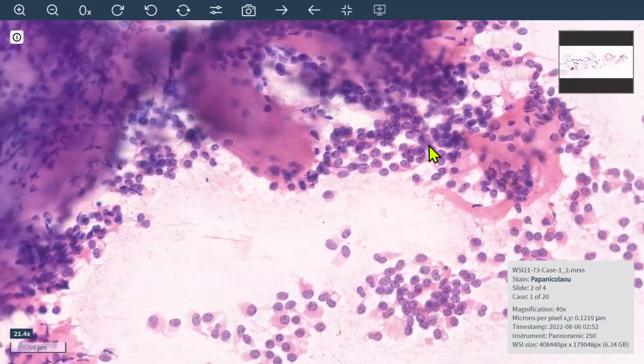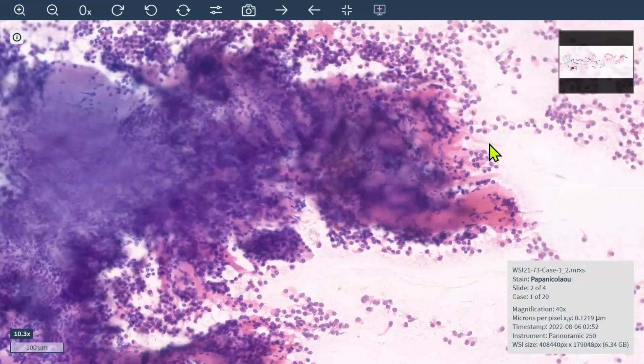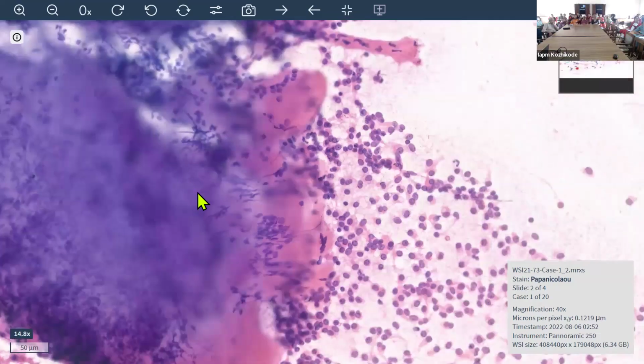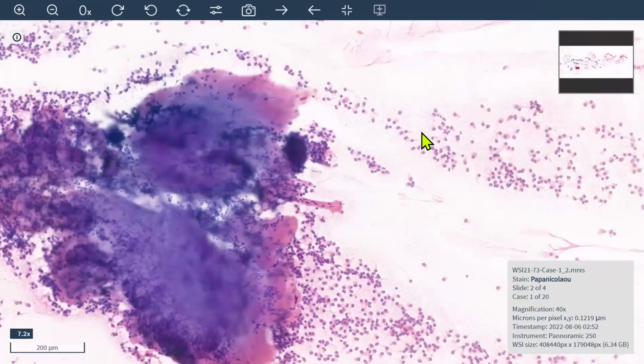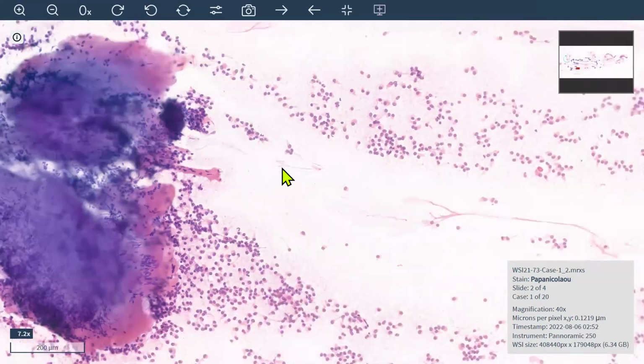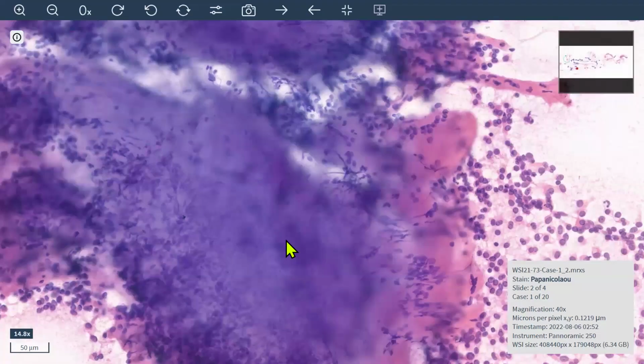Monomorphic cells, papillae. These are papillae lined by monomorphic cells. No one knows the diagnosis? It's a very classic appearance, one which I've already told you just now. Yeah, it is a SPEN. These are monomorphic cells, and you're seeing all these vascular structures. That's why I said if I show you a picture, it is easier. But when you get a slide, it's a little difficult.